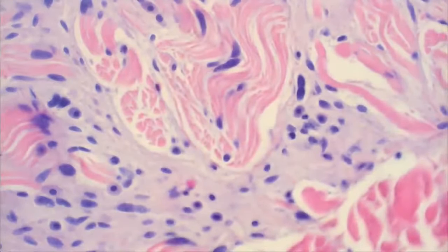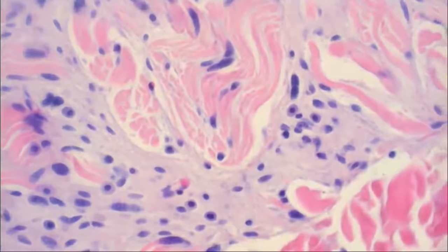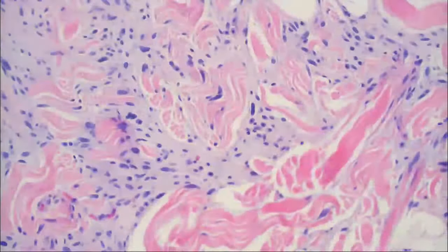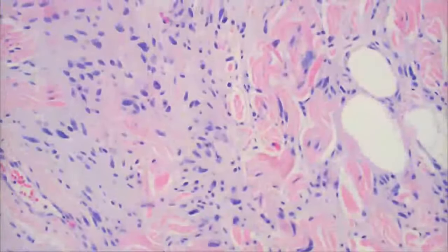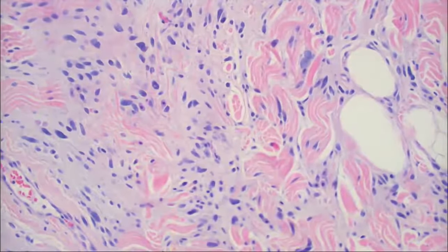Yes, they look like fried eggs. Fried eggs, yeah. Mast cells. Excellent. So lots of mast cells in here. We see mast cells anytime there's a lot of mucin. And there is quite a bit of mucin in here, isn't there? Yes. And then you've got these other cells that do look kind of spindly in a way. They're kind of blunt, a little bit pleomorphic. Those look like the fibroblasts.